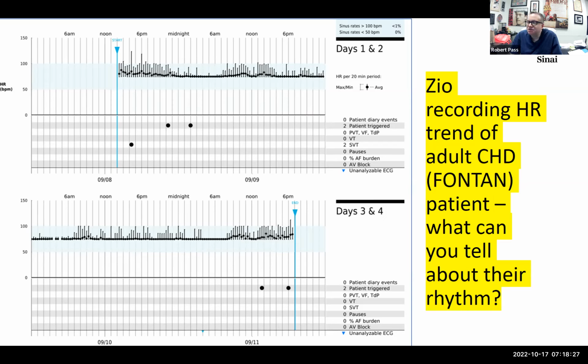An interesting observation also is, this is an adult patient, presumably is active, and probably has the feature of rate responsive on. So as we all know, pacemakers typically have some kind of a sensor, the most common being a piezoelectric crystal that can detect motion, and the device is programmed to slowly raise the heart rate from the lower rate limit when it detects motion to try and simulate what happens with sinus, as the sinus node increases, typically with sinus acceleration with activity.